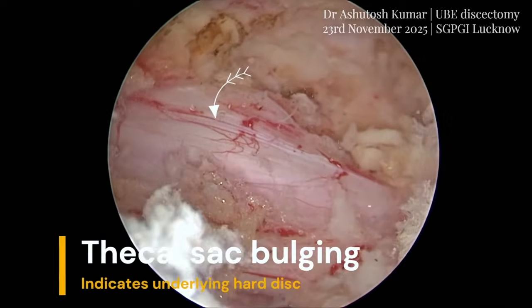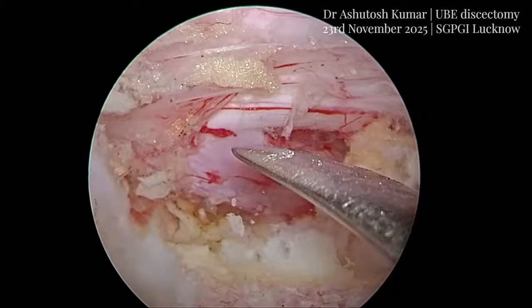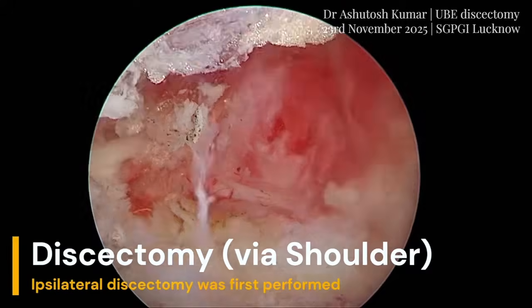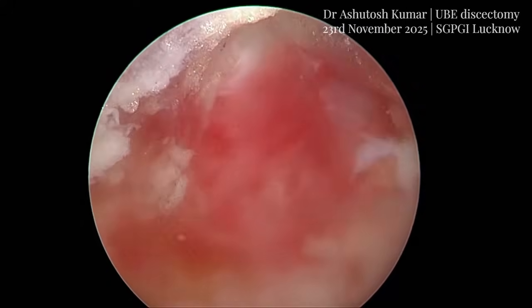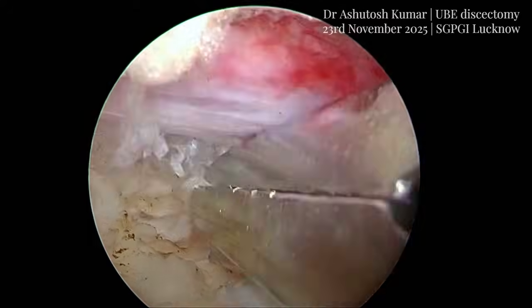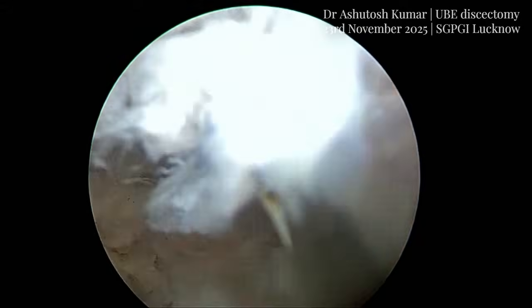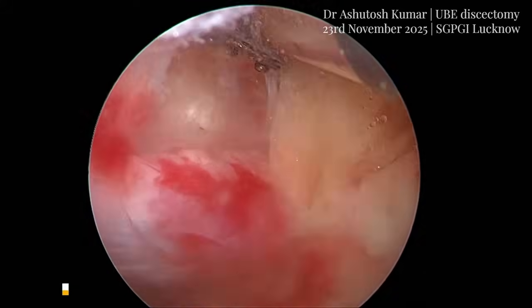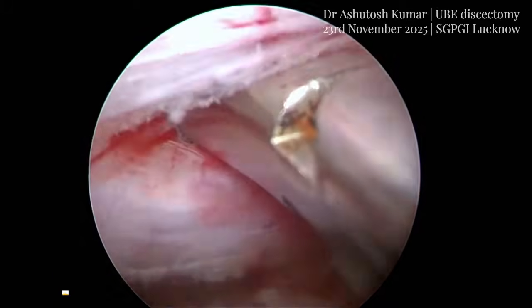At this stage, the thecal sac was seen bulging towards the contralateral side. An ipsilateral discectomy was first performed. The disc was found to be large and calcified. The annulus was incised using a number 15 blade, followed by piecemeal decompression. Here, the hard bulge of the disc compressing the traversing nerve root can be seen. The central canal component of the disc was removed through a transaxillary corridor.